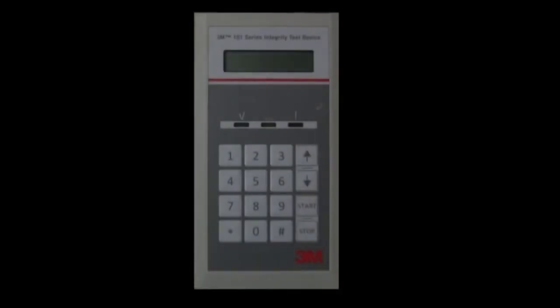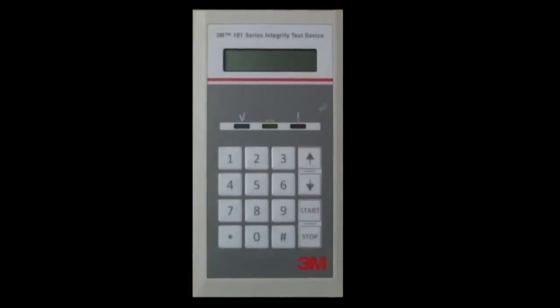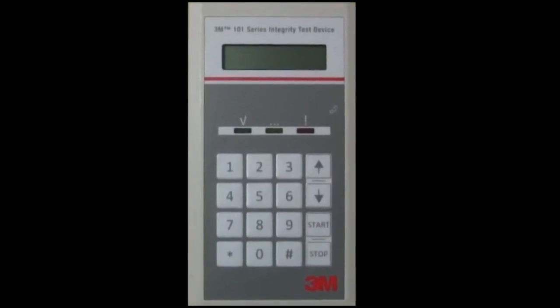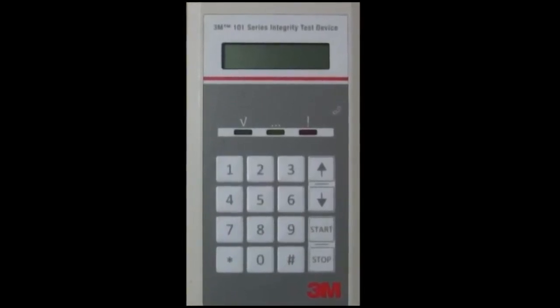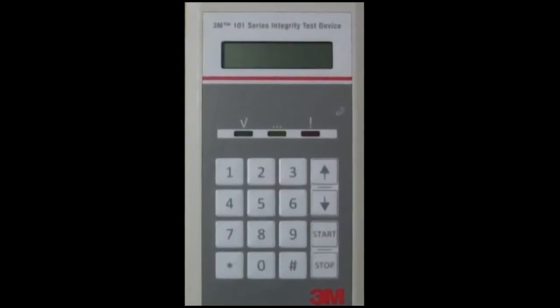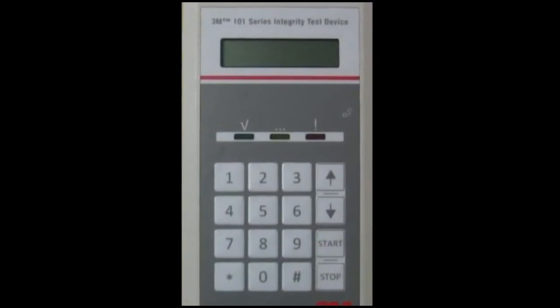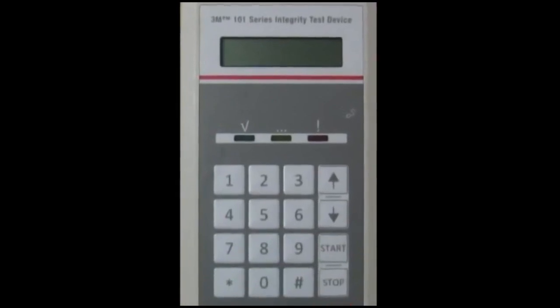The 3M101 Series Automated Integrity Test Device can communicate with most wireless printers to generate a hard copy of test data.